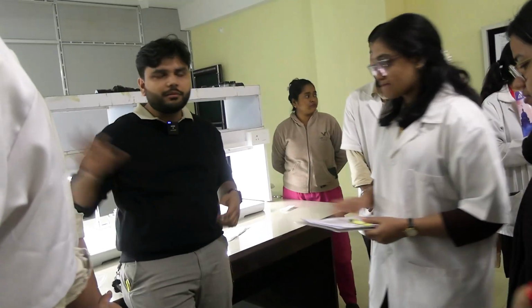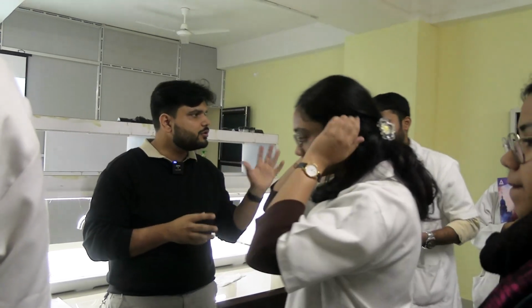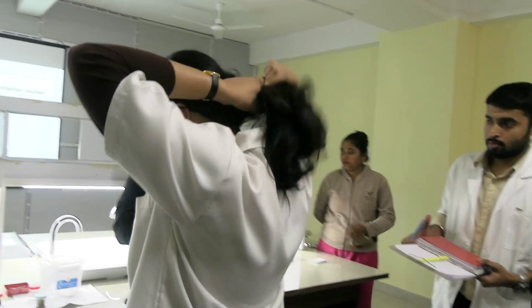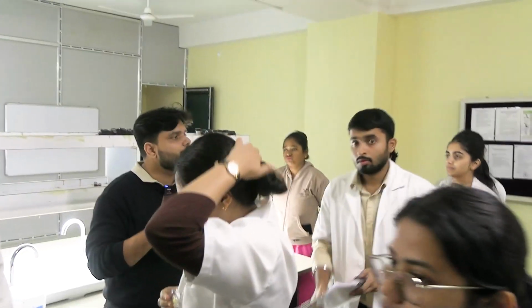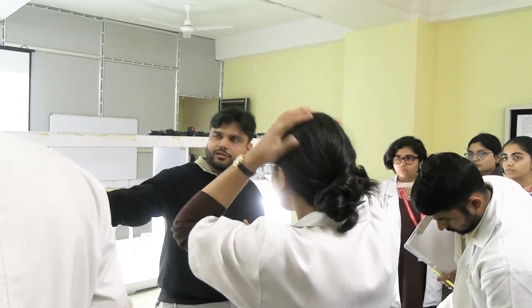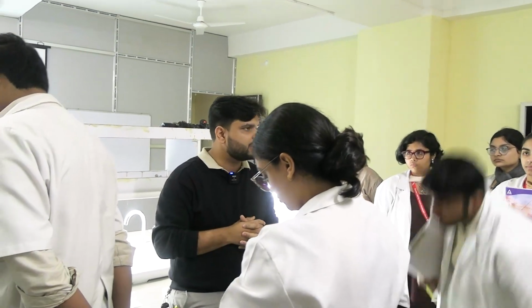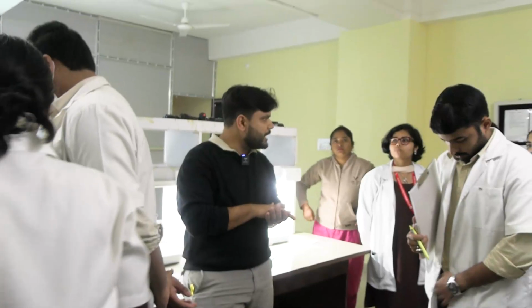In the meantime that they are doing, I'll just tell you guys something about the concentration methods, because you have to write about concentration method. Okay, first of all, in case of stool examination, the first and foremost thing is to see it macroscopically. Okay, the people who are not doing, you should listen. And you should see here and open your ears so that you can at least hear what I'm saying. Okay. So first is the macroscopic features.